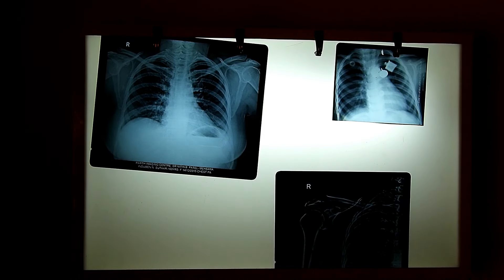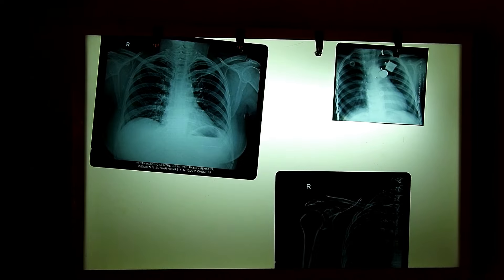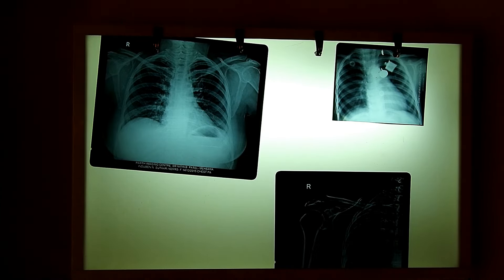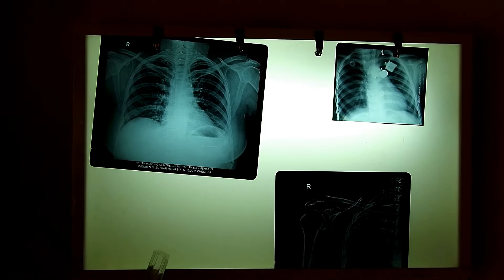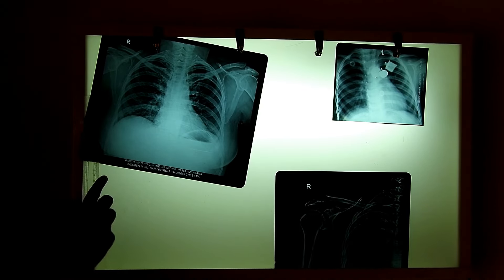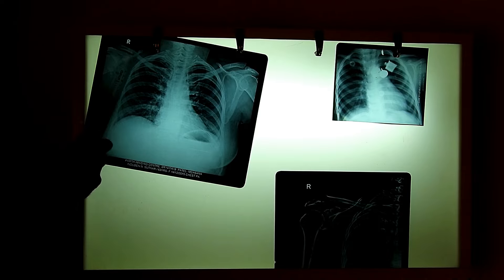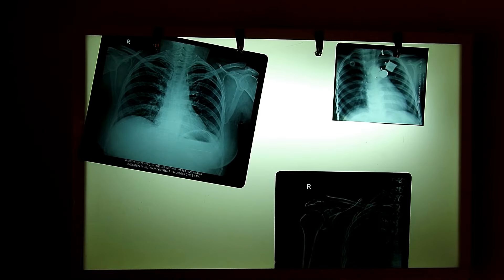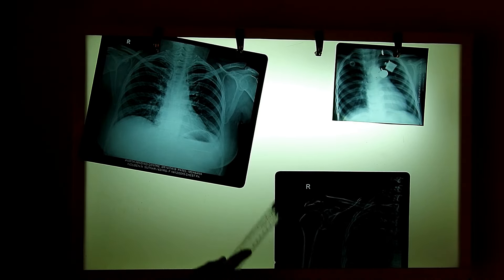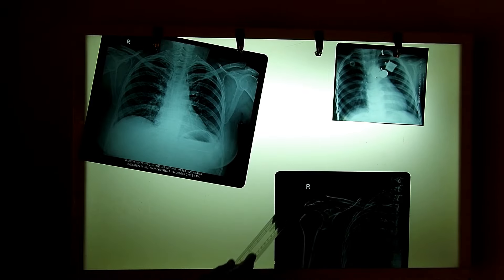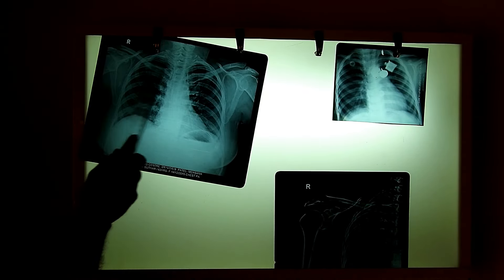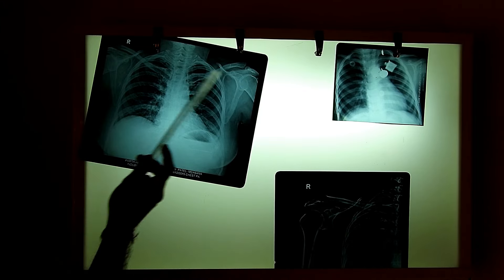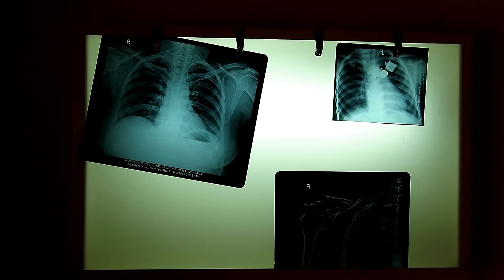The next thing to identify is the side of the X-ray — whether it is the right side or the left side. This is clearly indicated by a marker: R for right and L for left. Here this is the right shoulder, and in the thorax X-ray, this is the right side and the opposite is the left.